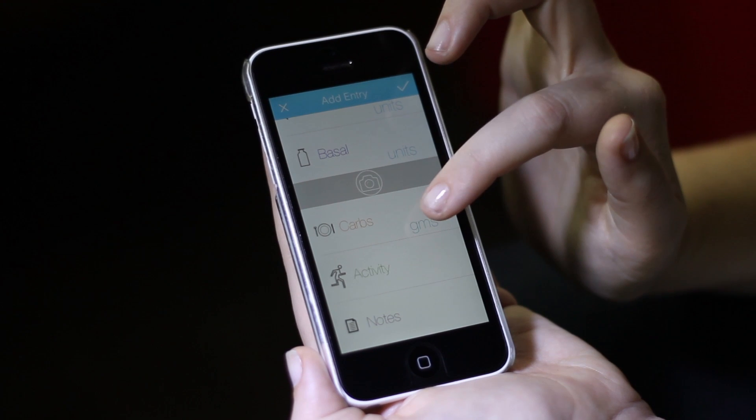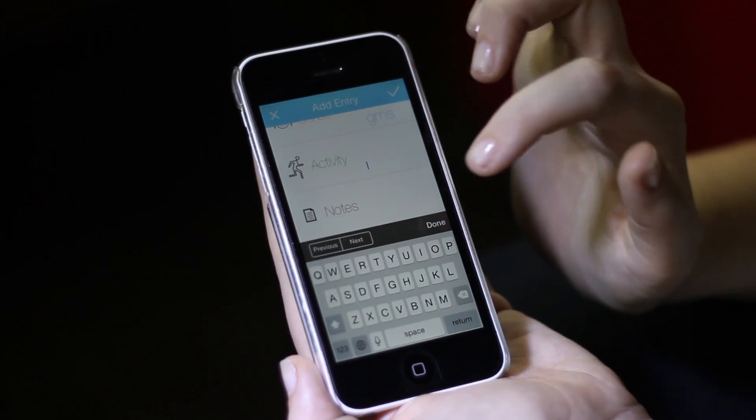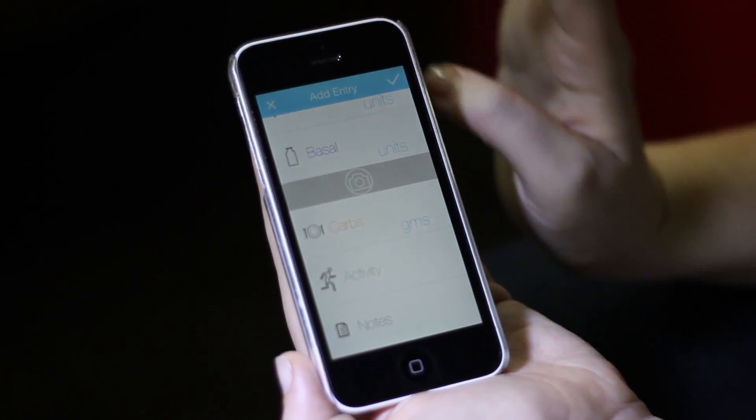I'm not taking a shot, so I'm going to go down to the photo option in case I want to take a photo of my food. You can also put your activity and your notes in here, and then you're going to save your reading.